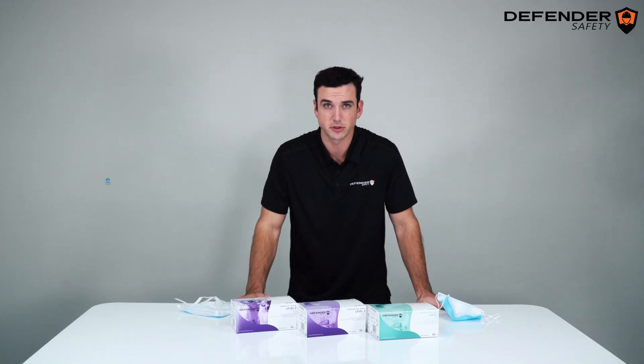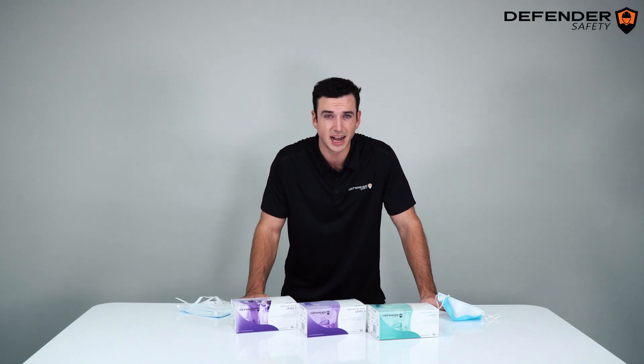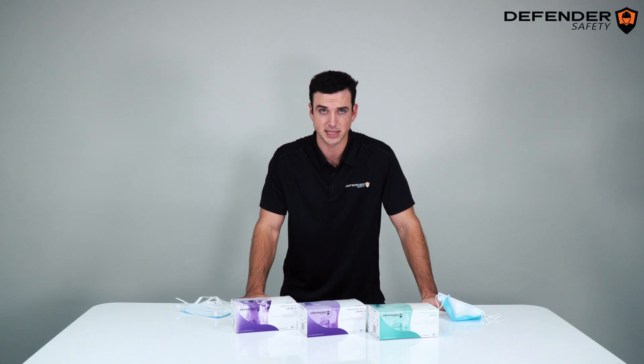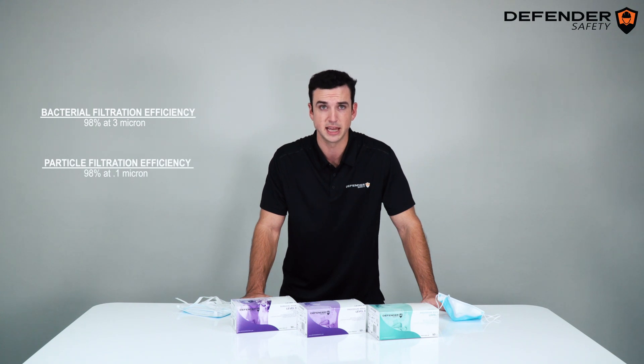These masks undergo the Level 3 F2100 ASTM standards, which means you will receive even higher performance for situations where an enhanced liquid barrier is needed. These standards include 98% bacteria filtration efficiency, 98% particle filtration efficiency, and a 160 mmHg blood splatter rating.